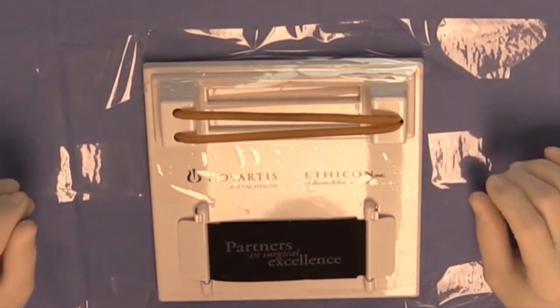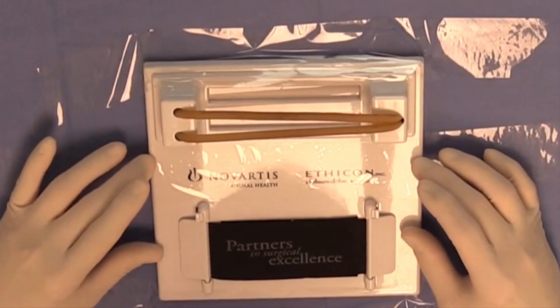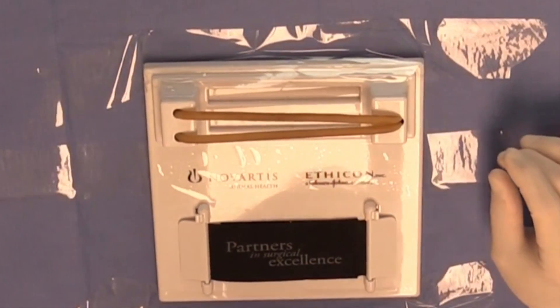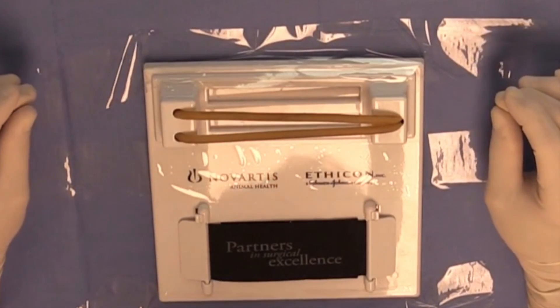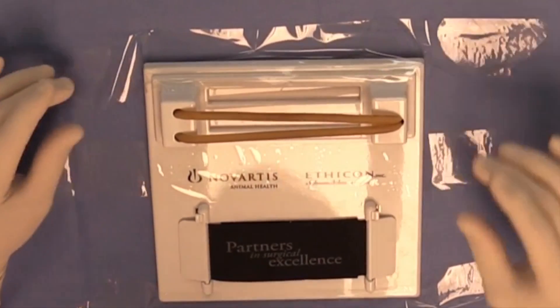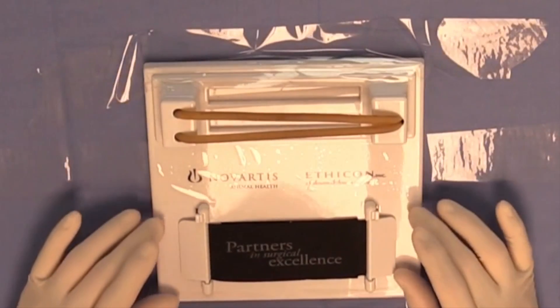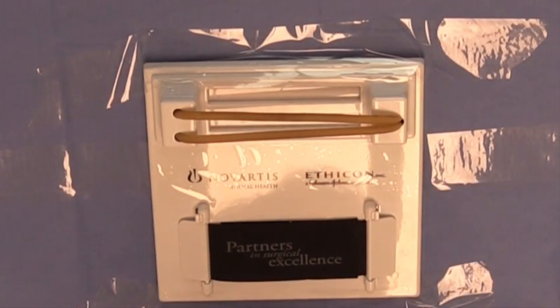What you see in front of me right now is the Ethicon Knot Board. In surgical principles, every student will be provided or loaned an Ethicon Knot Board at the beginning of the course, and then it's returned to us at the end of the course. This Knot Board is primarily where you are going to practice your hand ties, but it can also be used for practice with suture techniques.